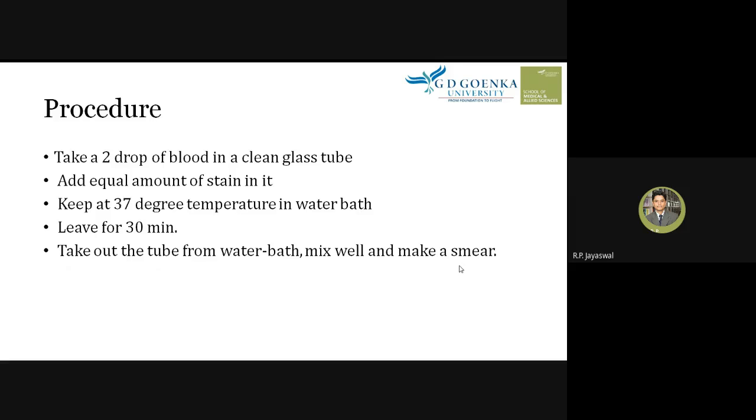So you have to prepare the blood smear. There is some special procedure to make this smear. There are thin smears and thick smears. So you need to do some practical work. It's hands-on training you have to do so that you can become an expert at making a smear. Okay. Once you make a good smear, dry the smear and examine the smear under the oil immersion objective.